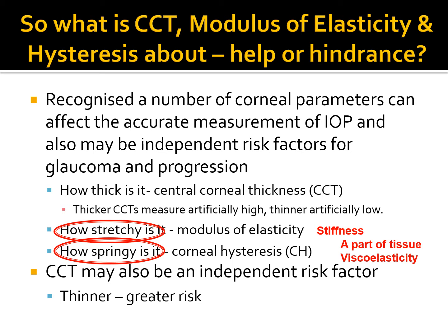Well, hysteresis technically is simply one part of a tissue's viscoelasticity. Because this is the sort of stuff that is bandied around, I feel it's important to take time to explain how this really works. It's convoluted, it's long, I'm sorry.